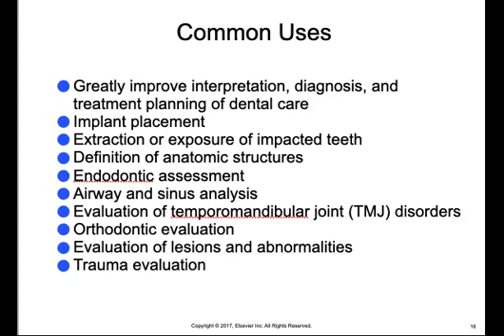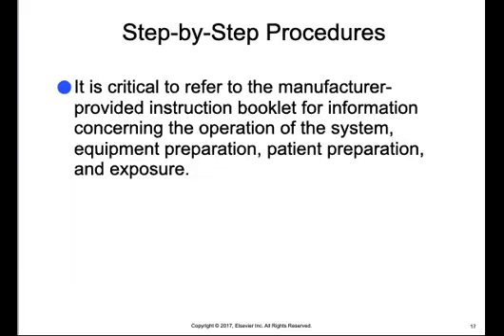Comprehensive examinations and interpretations should be completed and documented with the overall health of the patient in mind. So it is critical to review the manufacturer's provided instruction booklet for information concerning the operation of the system. As far as step-by-step procedures go, we need to make sure that we're consulting the manufacturer's booklet, because every machine is different, and patient preparation, equipment preparation, and exposure are going to be slightly different for every model.